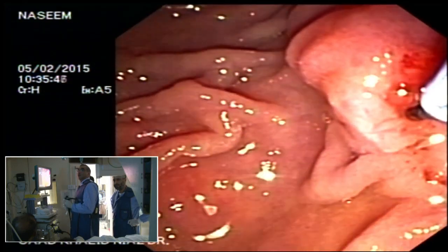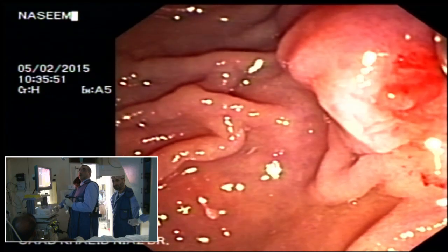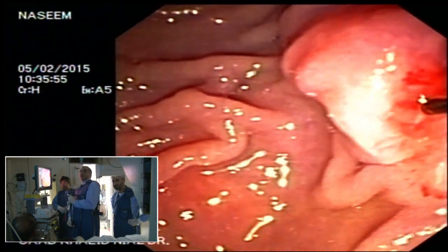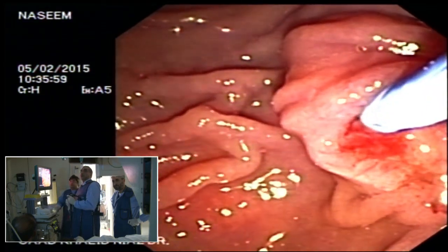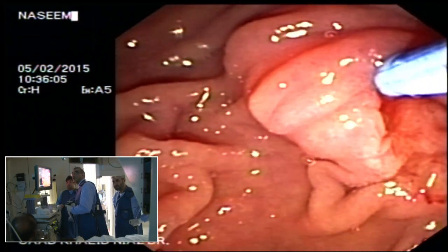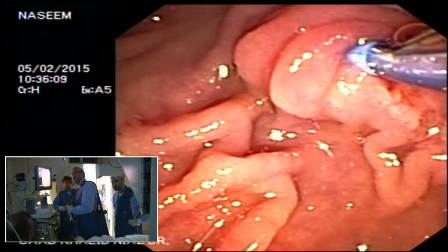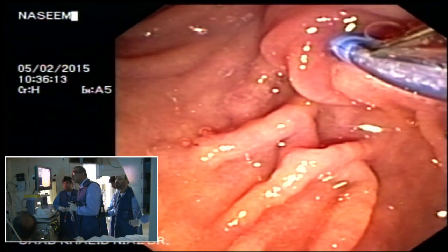So that exactly is right. I know after 5 times that I'm very unlikely to get it. And I know what my safety net is going to be with needle knife. When I look at both of them, I know that doing needle knife at a certain time is much safer than me continuing. It's all dependent on the experience.